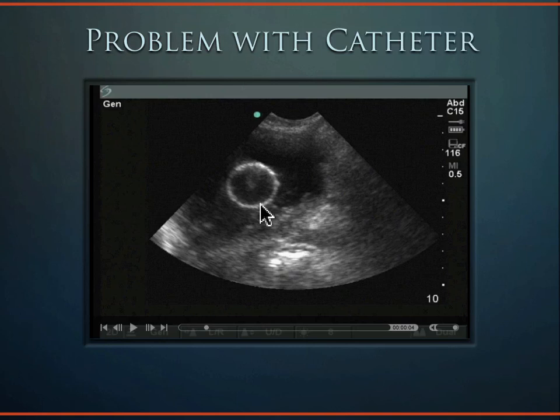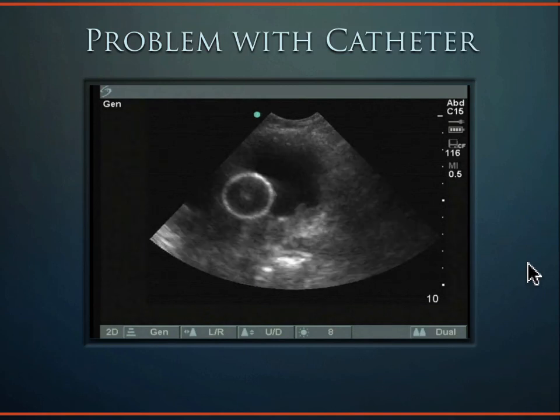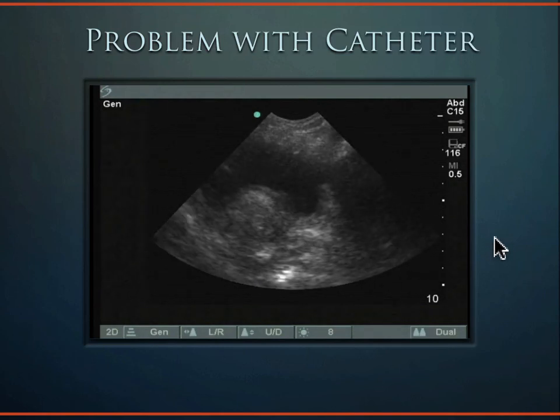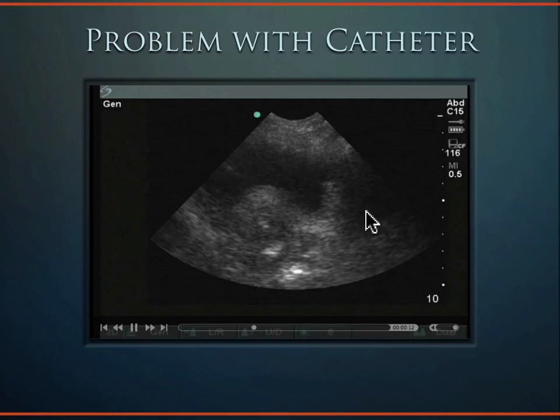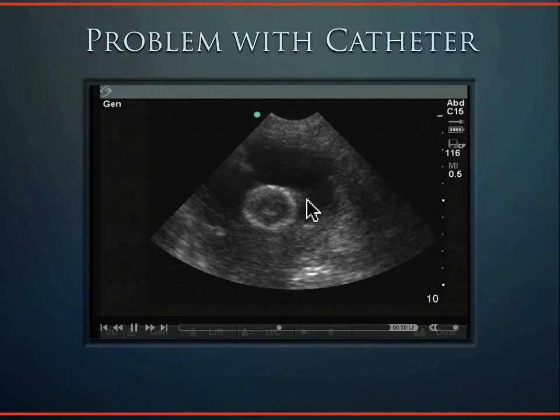And so you're sitting here scratching your head. You're like, man, do I just walk away and let nature take its course, pretend I didn't hear him say that? Or do I figure out a way to solve this problem? So we went back in the room, and here we can see his balloon here. And I thought about the suprapubic bladder, everything.